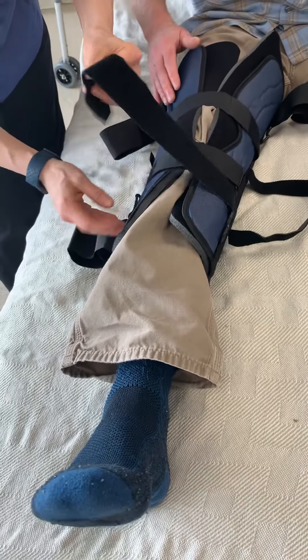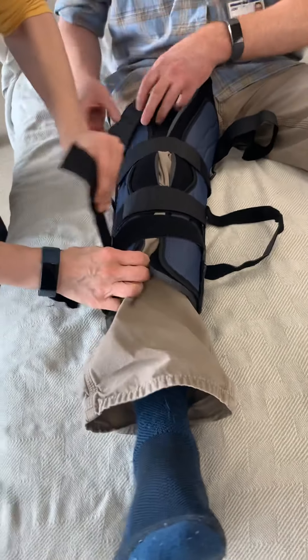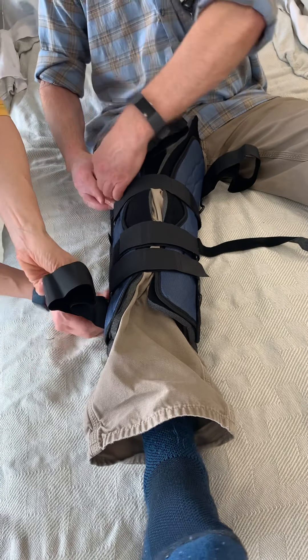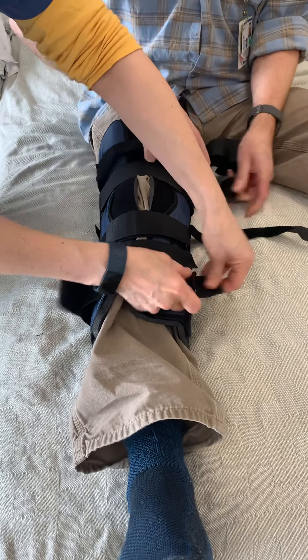It's really nice that the patient can help you on the upper part — they can do the upper straps and you do the lower. But not everybody can do that.